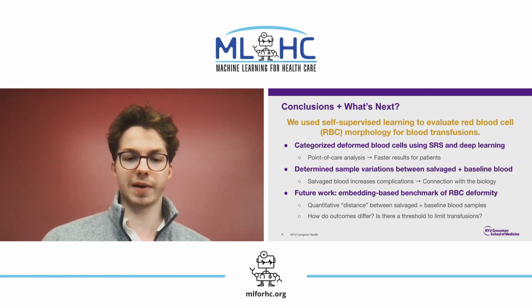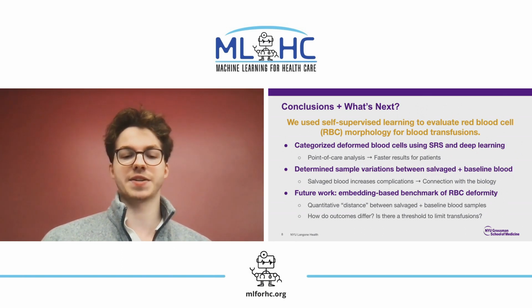Our future work will aim to develop an embedding-based benchmark of red blood cell deformity, measuring the distance between salvaged and baseline blood samples, and analyzing whether outcomes differ when it's above a certain threshold of difference between the two samples.